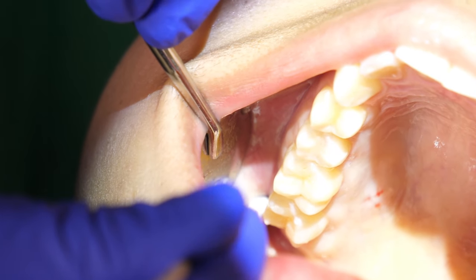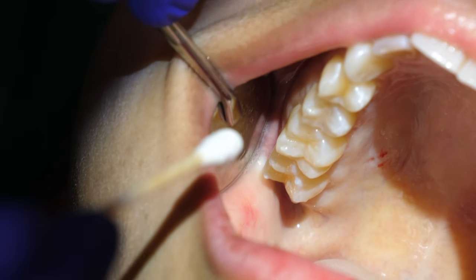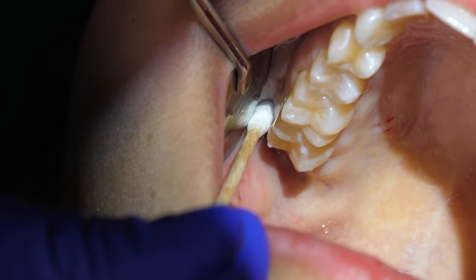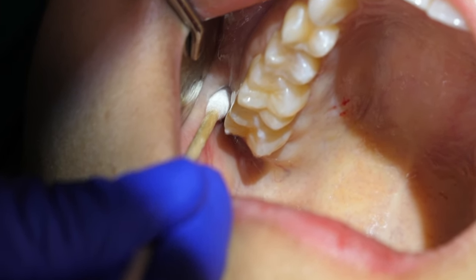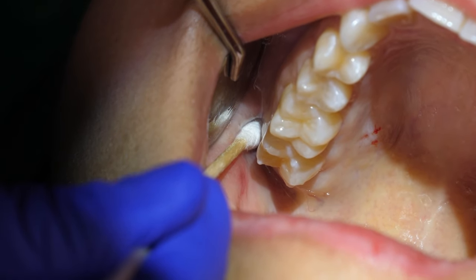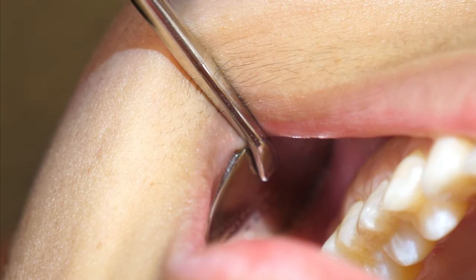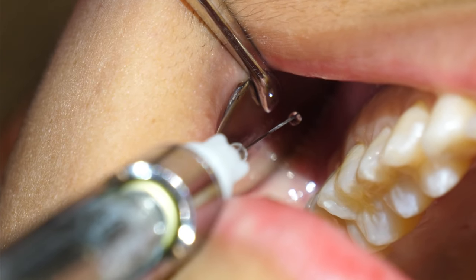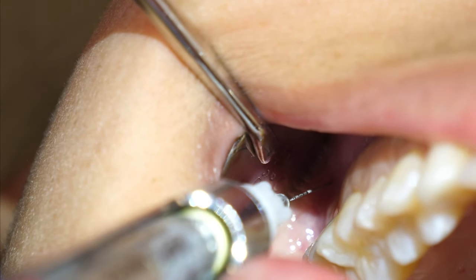This injection also anesthetizes the buccal periosteum, buccal mucosa, and buccal gingiva adjacent to the anesthetized teeth. The deposition site for the PSA injection is the PSA foramen, where the PSA nerve is located. This can be accessed by inserting the needle at the mucobuccal fold just posterior to the zygomatic buttress.